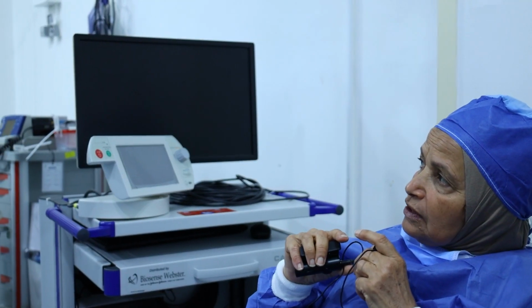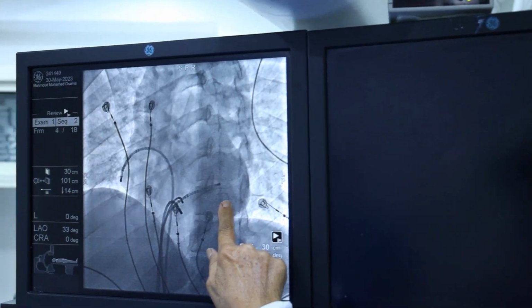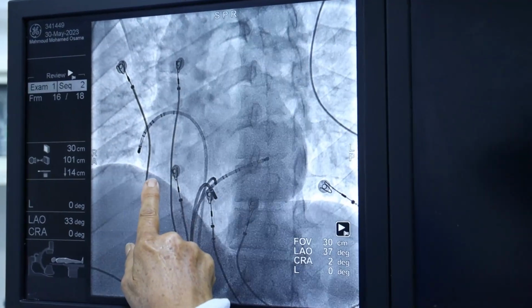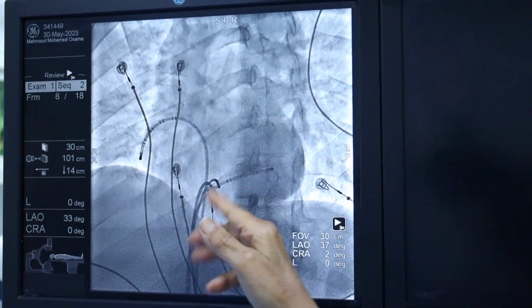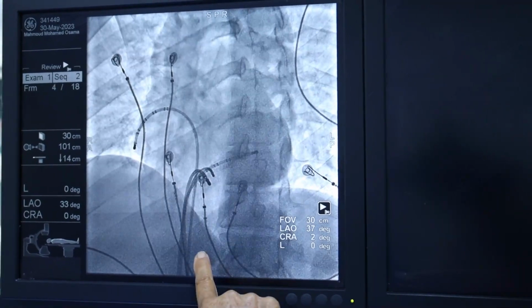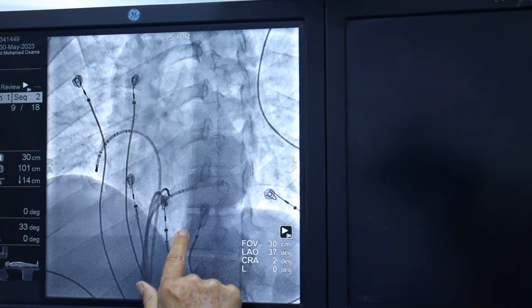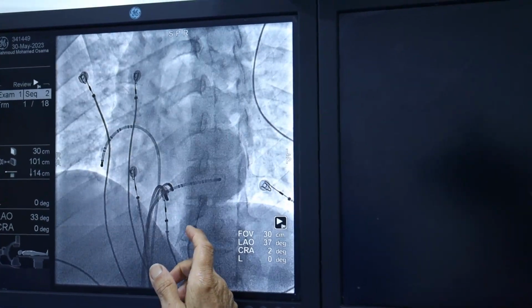We'll show you the placement of the catheter, finished with the ablation, and we are now in the waiting period. The 7 French decapolar catheter is in the CS, and the other one in the right atrium instead of the halo. This catheter was not stable, so it kept jumping. This is the ablation catheter in the septal region of the isthmus.